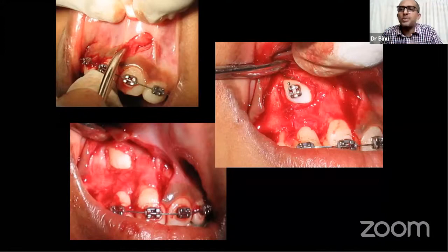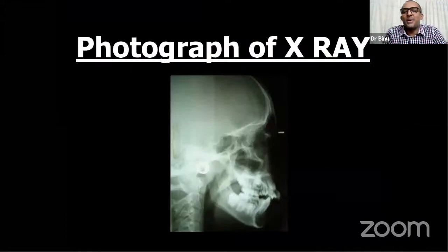Give new gloves to the surgeon. Now you check an Indian journal of oral surgery and you can see all blood here and there. But then compare with the international journal. So neat, perfectly taken. That is the difference I'm talking about. All that you need for that is the attitude. Asking the surgeon, see, I'm documenting this particular procedure. So at every stage, please clean up completely, put on a new pair of gloves, retract nicely for me. Let me take a picture. That's what I mean. It's not wedding photography going on here.